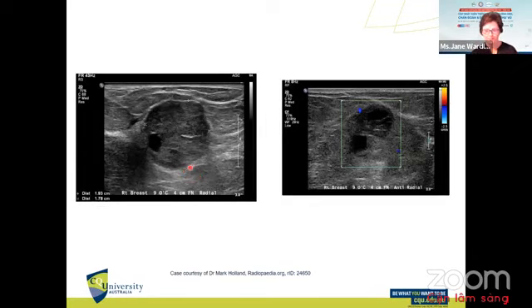We put Doppler on this one, there's only a tiny demonstration of colour Doppler there, so a little vascularity. So it's not really obvious that there's a vascular supply there. But it did have enough concerning features that it did need follow-up, according to BI-RADS. And this one came back as a mucinous carcinoma, which is rare, but it's a type of IDC. So it's good that this finding was good for the patient, because it could be followed up and hopefully had a good patient outcome.